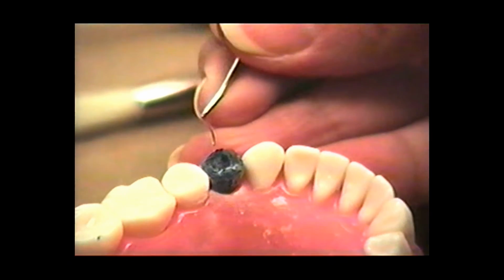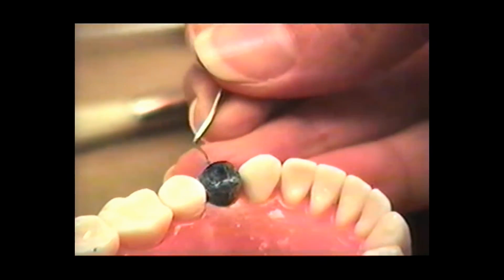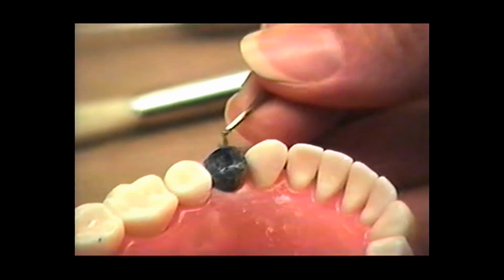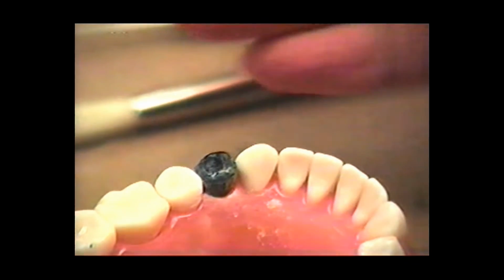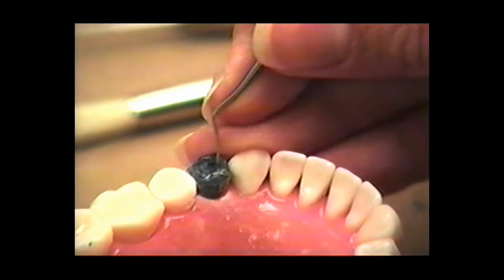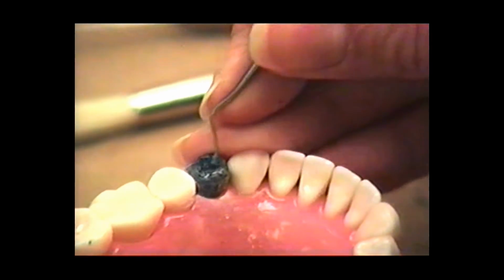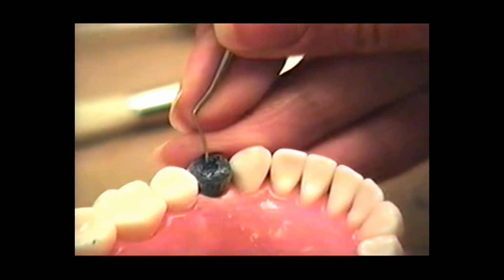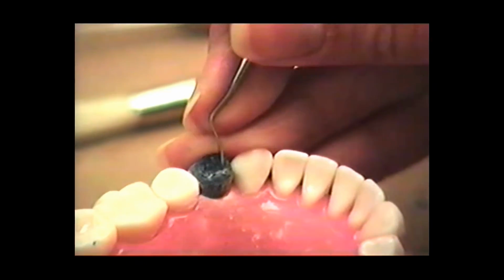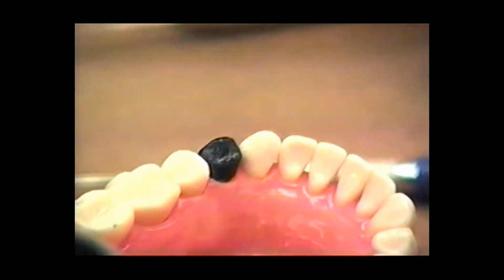You just kind of carve those areas back. I'm going to bring the cusp tip down a little, round it just a little bit as I do it. And the base of the dent is probably going to remain. That's good because that's your contact. Okay? And then I'm going to take this triangular ridge, keeping away from the cusp tip, and I'm going to go ahead and reduce that a little bit and round it as I'm doing it. As you do it, you're reshaping it back to the shape you want.